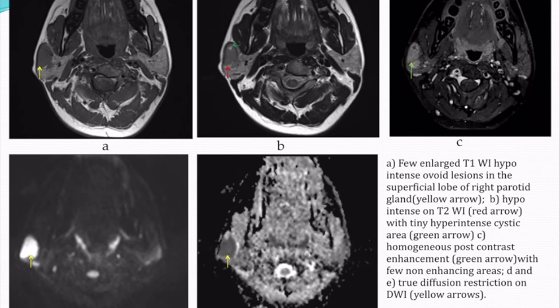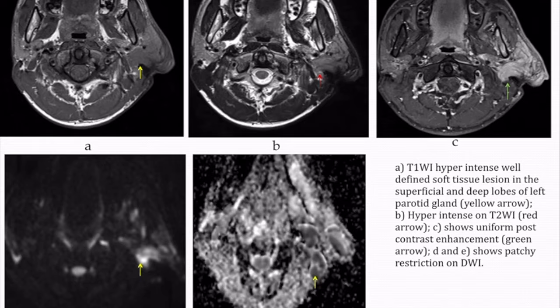Axial MRI images showed a few well-defined T1 hypo-intense lesions in the superficial lobe of the right parotid gland, appearing hypo-intense on T2-weighted images with a few tiny hyperintense areas within. The lesions showed homogenous post-contrast enhancement with a few non-enhancing areas. True diffusion restriction was noted. The diagnosis given was Warthin's tumor based on multiplicity and imaging findings, which was confirmed on pathology.